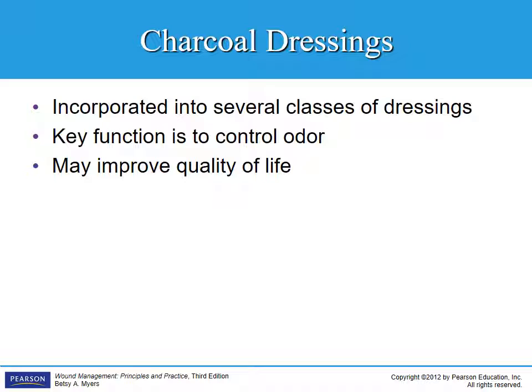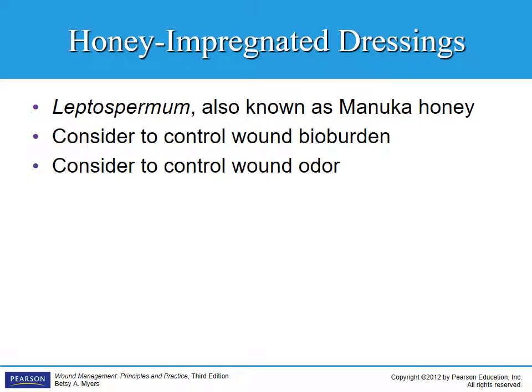Let's talk a little bit about charcoal dressings. Again, the key function for a charcoal dressing, there's nothing else other than to control the odor. If your patient has a wound that has a high odor to it, it's going to improve the quality of their life, because socially that's not something that a patient's really going to put up with. If there's an odor to the wound, they'll tend to keep themselves at home or keep themselves away from people. So if you need something to control odor, a charcoal dressing, that is the only purpose of a charcoal dressing, is simply to absorb odor.